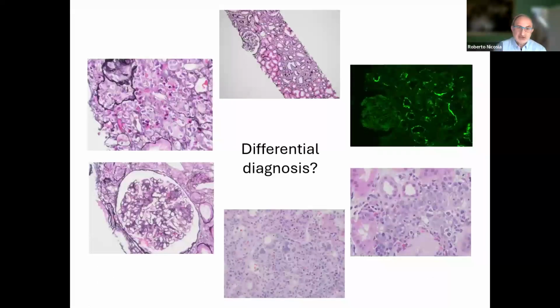So with this constellation of findings, what would be the differential diagnosis? Any thoughts, suggestions?